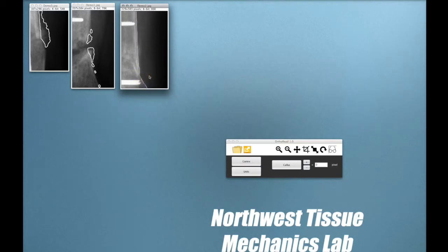One of the really cool features of OrthoRead is that as you navigate between images, OrthoRead will update the results field to reflect the results of the active image. OrthoRead also remembers the current step of callus segmentation the user is in, so the user can come back to an image and finish the process if necessary.